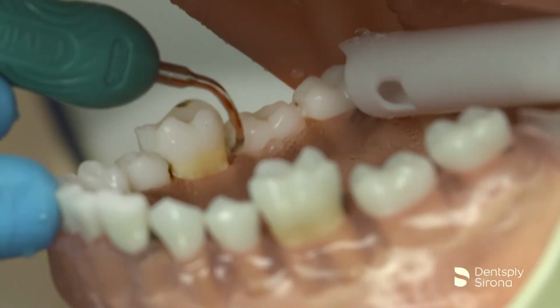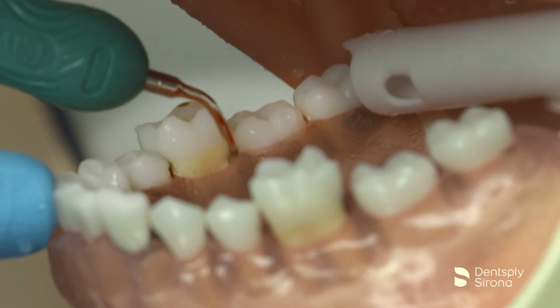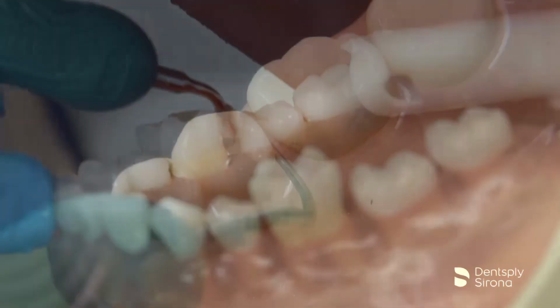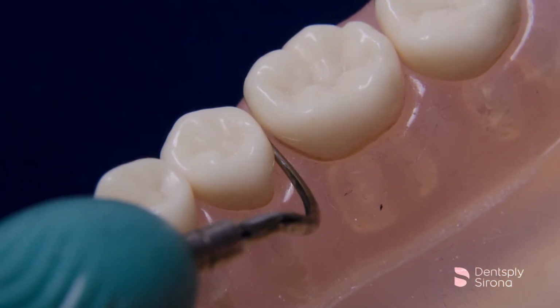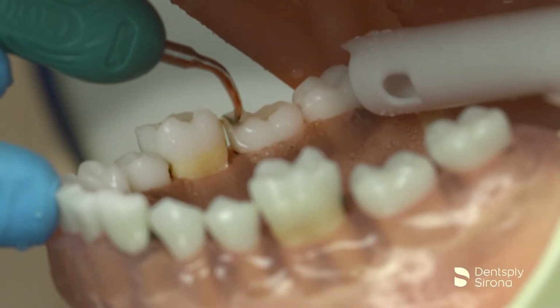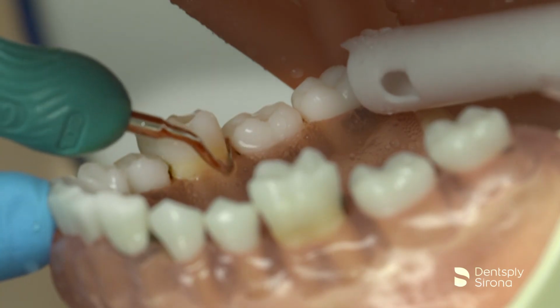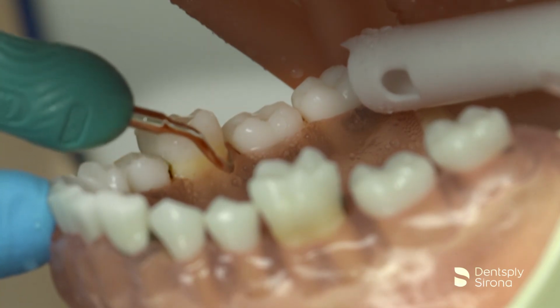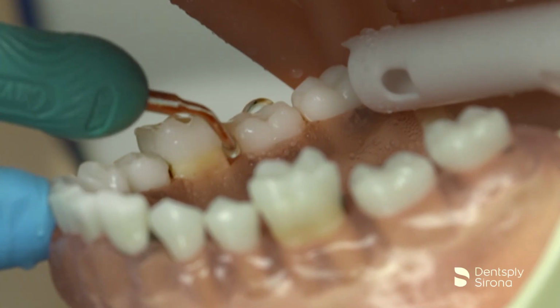The curved inserts are ideal to reach under the contact areas supragingivally in what is known as the transverse approach, similar to using a Nevi or a 204S posterior sickle scaler. The curved inserts can be adapted to the mesial and distal surfaces utilizing the lateral surface of the tip. Note in this demonstration, the clinician is using proper adaptation for transverse approach, supragingivally under the contact.